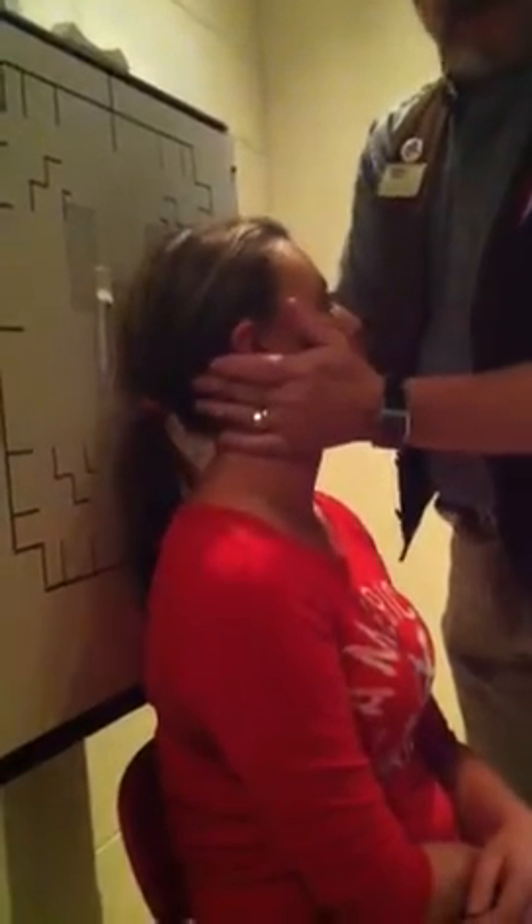Of the stem — like Bruce, except that it's 10 degrees instead of 12. Caudal tube angle. This is Arsalan — 10 degree tube angle, caudal. Still a 45 degree rotation.